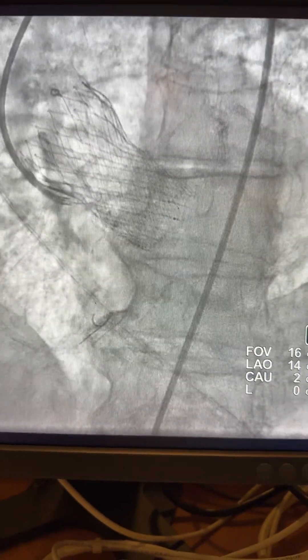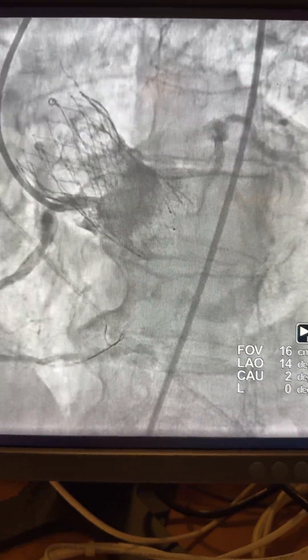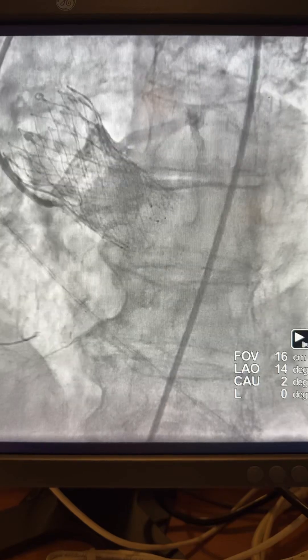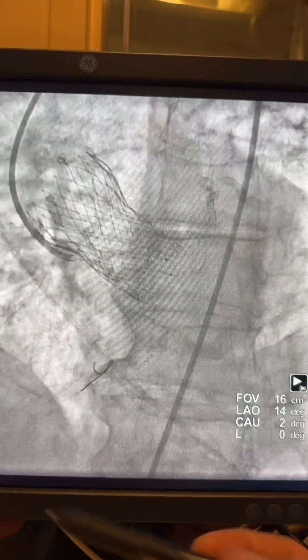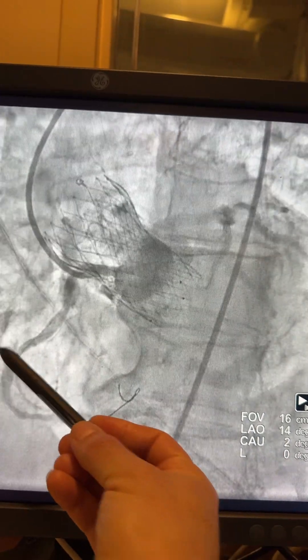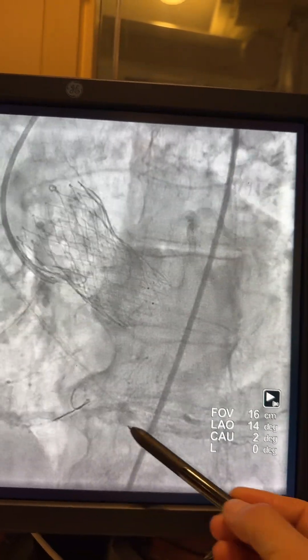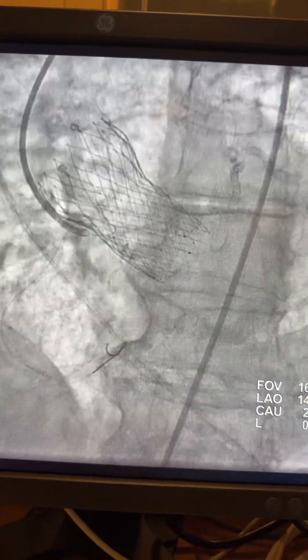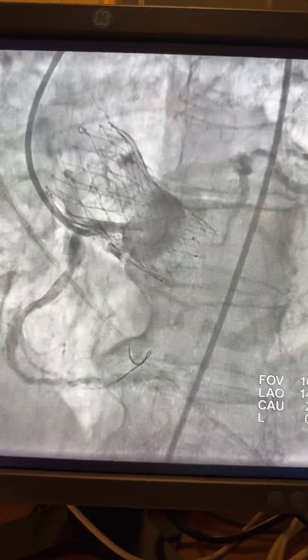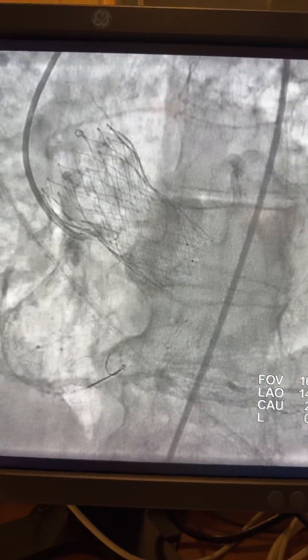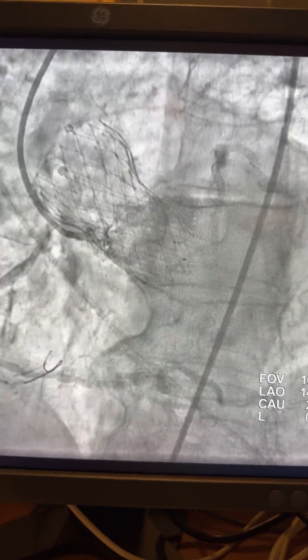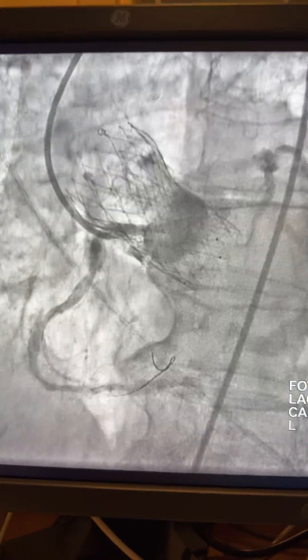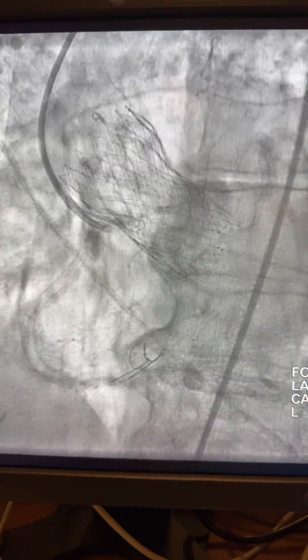Here I'm taking an angiogram. Still unable to visualize the RCA well. There is a lesion in the mid-RCA and there is a lesion in the PDA. So the next step is to advance the guideliner over the balloon.